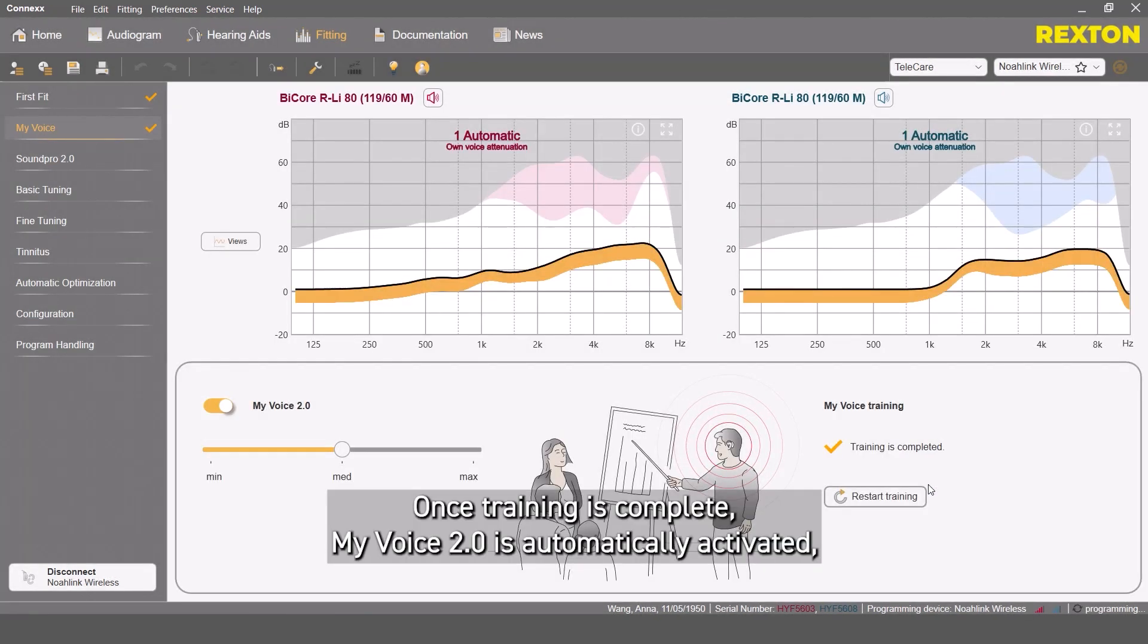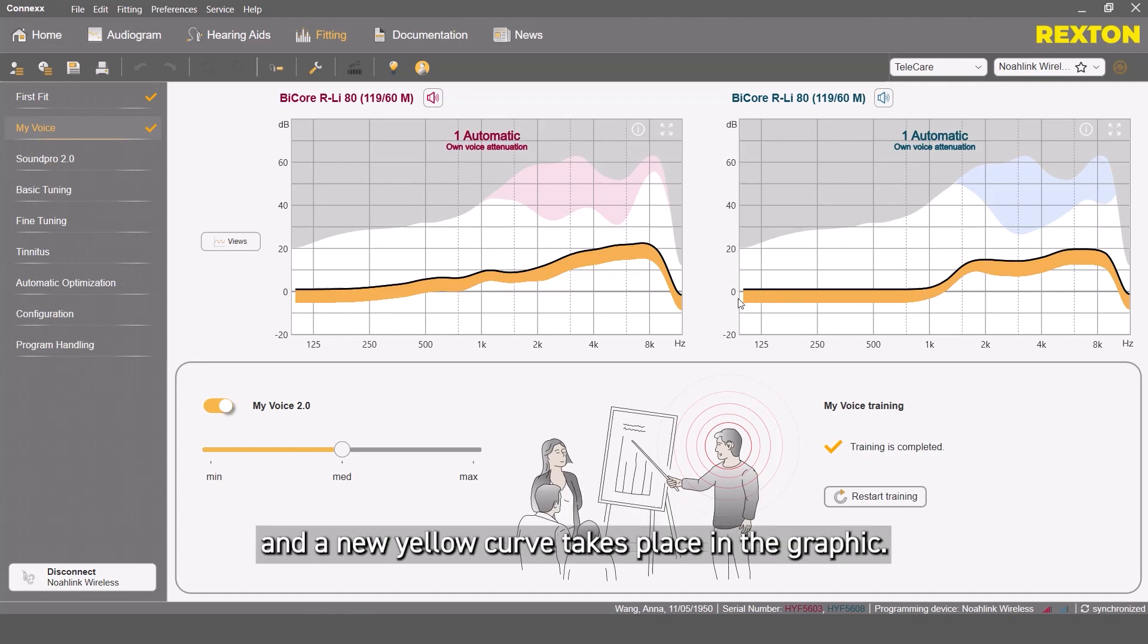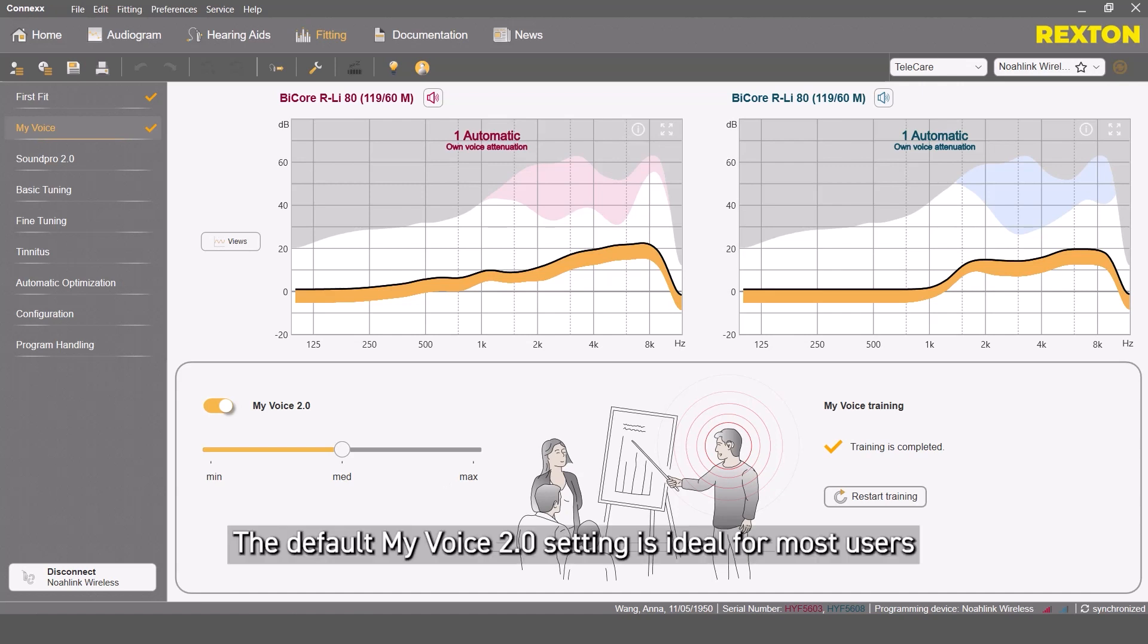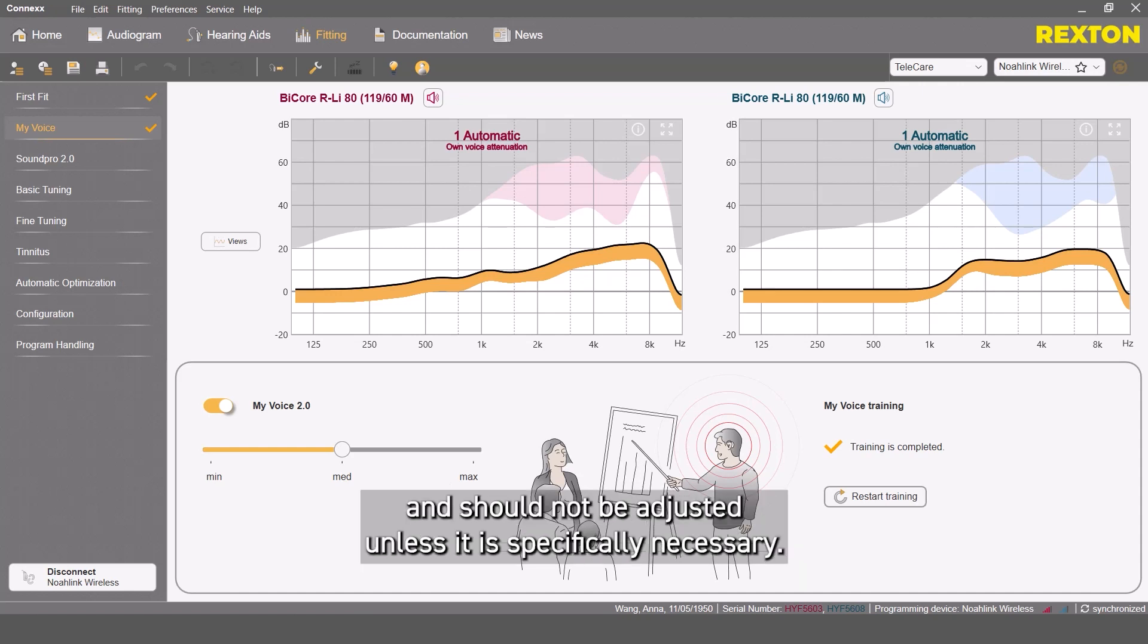Once training is complete, MyVoice 2.0 is automatically activated and a new yellow curve takes place in the graphic. The default MyVoice 2.0 setting is ideal for most users and should not be adjusted unless it is specifically necessary.